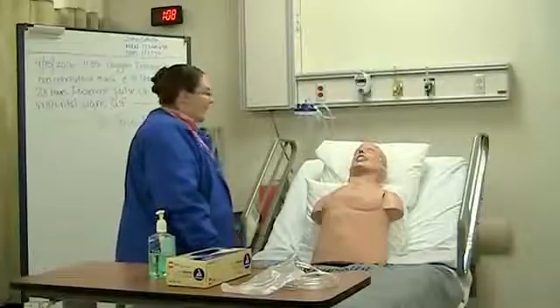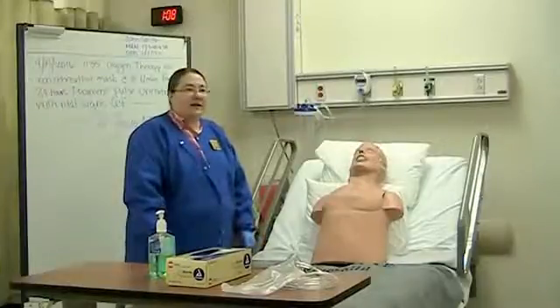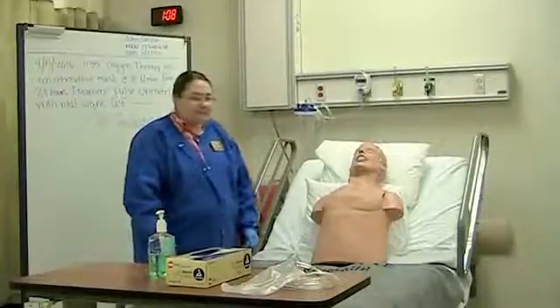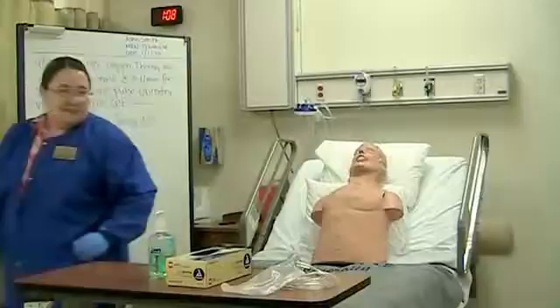Before we begin, I'd like to check your heart rate, respiratory rate, breath sounds, and obtain a pulse ox on room air. Now that I've completed my pre-assessment, I will go ahead and place the oxygen mask.